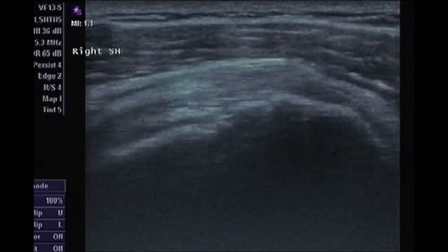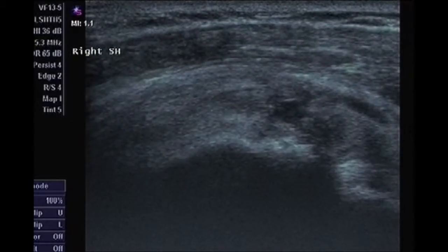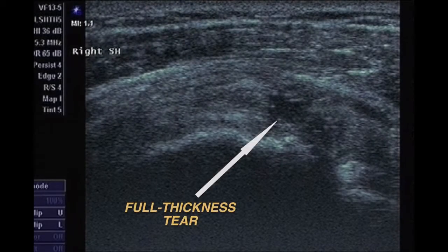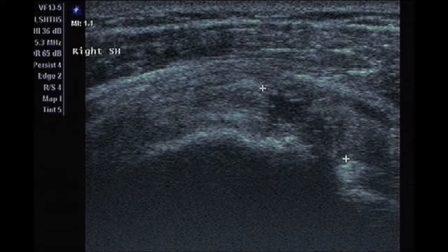On the transverse view there's a similar hypoechoic area at the end of the supraspinatus tendon to the right side of the screen. That's the full thickness rotator cuff tear, and in the transverse view this measures 16 millimeters.